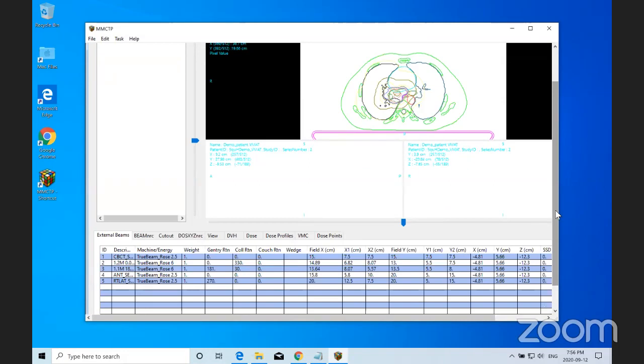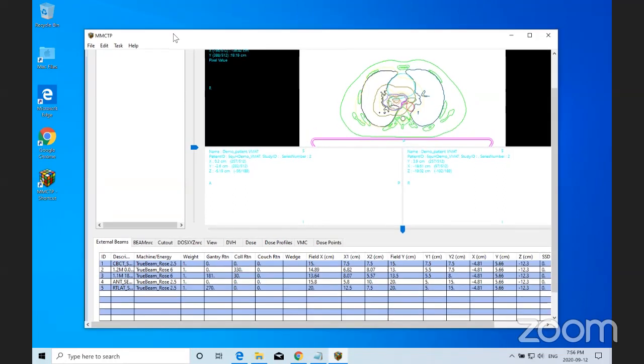So you notice the error messages when it was renaming. The renaming of a patient is quite destructive to the program, because just the way it was programmed, it has to rename folders and files. So it is problematic, and I wasn't too surprised when it threw up a bunch of errors. Probably the name is going to be okay, but the MRN or the ID might be the issue. But anyway, I'm just going to wait for the error message to pop up so that people can see this.